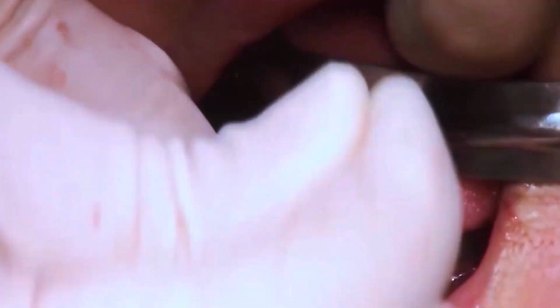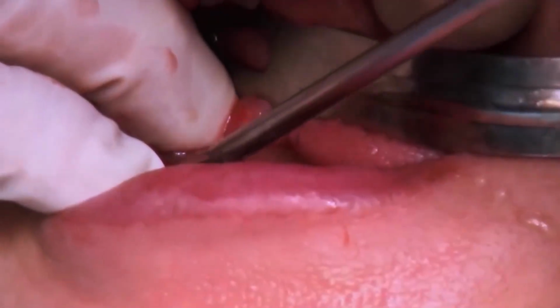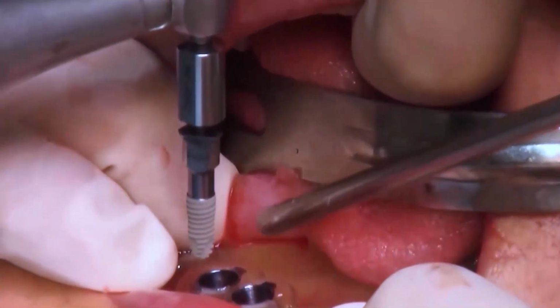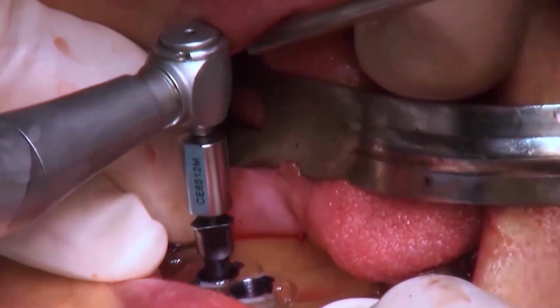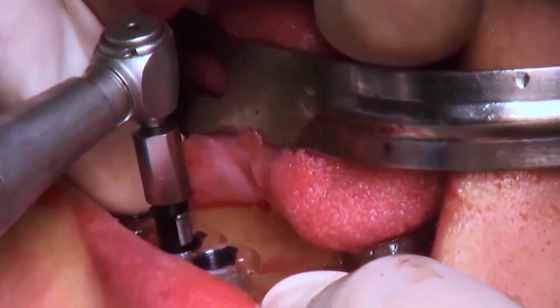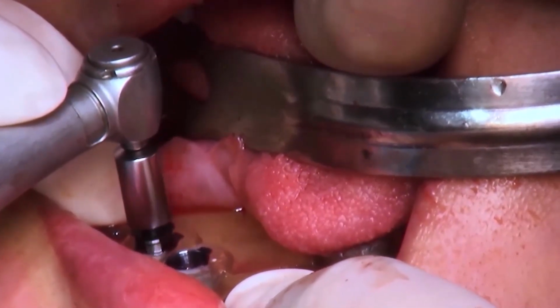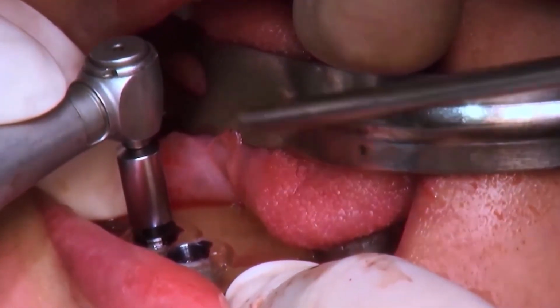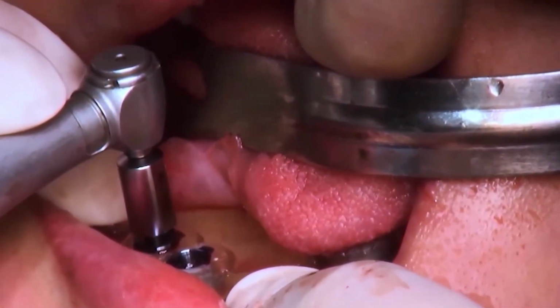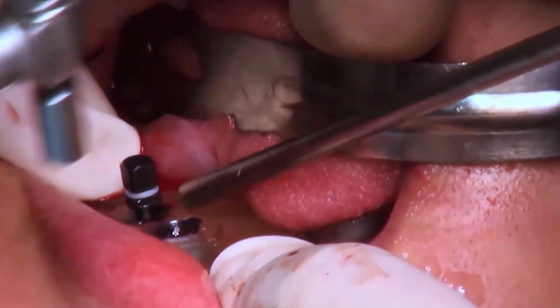I got a sense of initial strong stability of the implant. I also got a strong initial implant stability of the second implant.